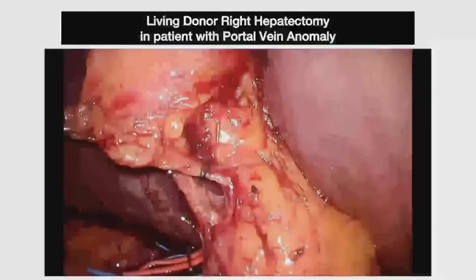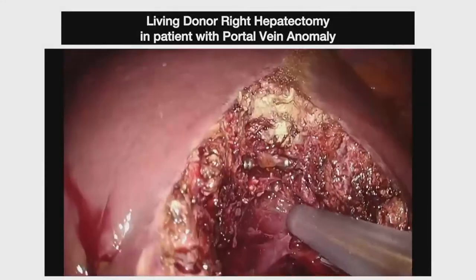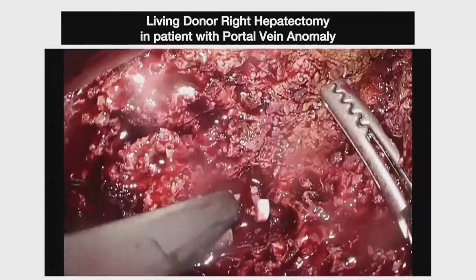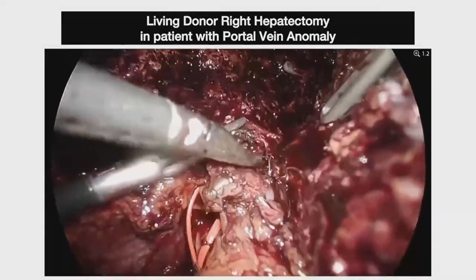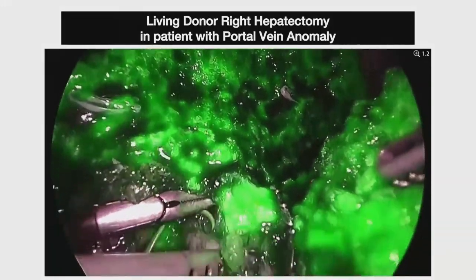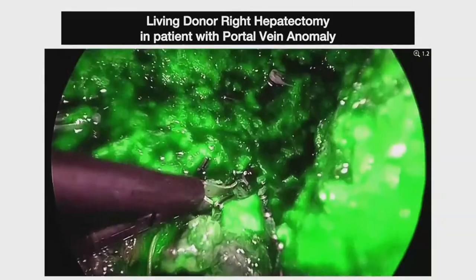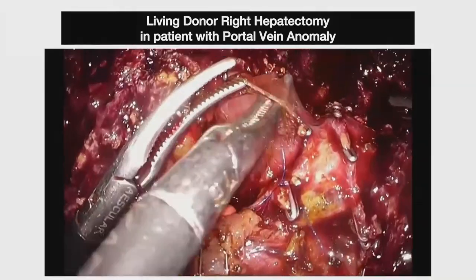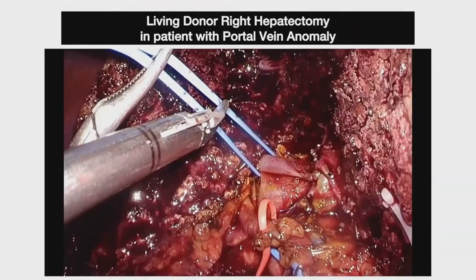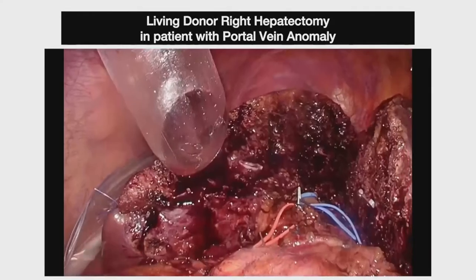After confirmation of the transection line by temporary clamping of inflow of the right lobe, liver parenchymal transection is conducted using laparoscopic CUSA and energy devices. V5 and V8 were also transected. The right hepatic duct was identified and transected using direct visualization of intraoperative ICG fluorescence cholangiography. After transection of the right hepatic duct, every portal vein branch of the right lobe was identified.